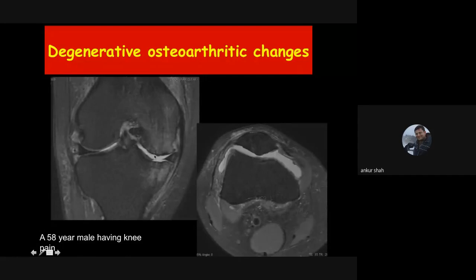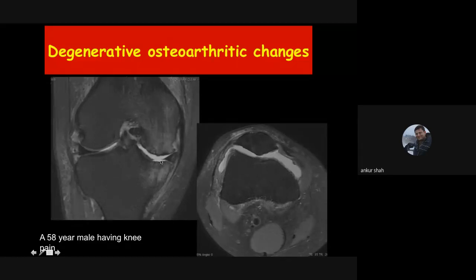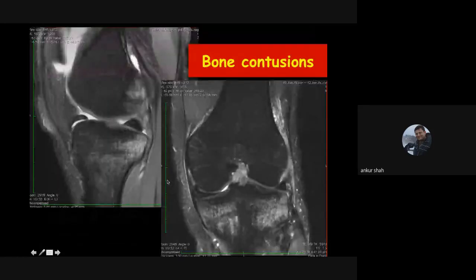Degenerative osteoarthritis changes on MRI show lateral femoral condyle cartilage present but complete loss of cartilage at the medial femoral condyle. The lateral tibial and medial tibial cartilage are also lost, with subchondral bone marrow edematous changes — the classic appearance of degenerative osteoarthritis.